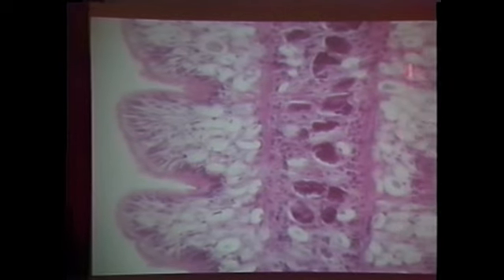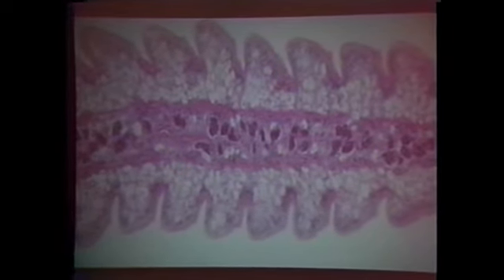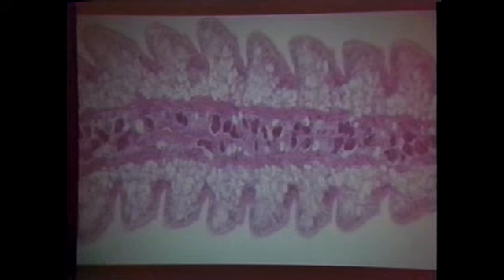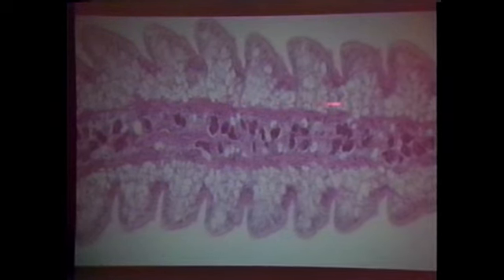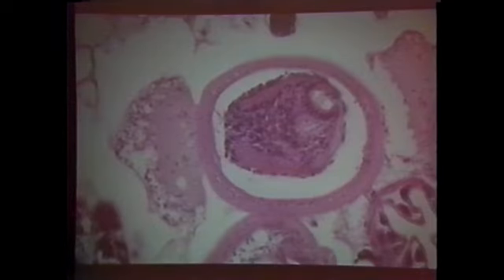I don't know who devised all these things, but I thank them because I use them all the time. And that's calcareous corpuscles. They are little football-shaped mineral concretions in the parenchyma of the organism. You can pick that up, and that's what allows you to call it a cestode versus a trematode, although cestodes have no digestive tract and trematodes do. But they usually are segmented. Look at this. Here are the segments, the adults and the intestine. And that's how you can tell it from a trematode.